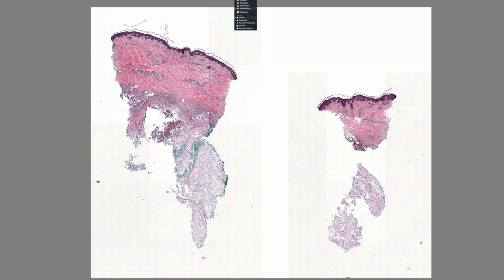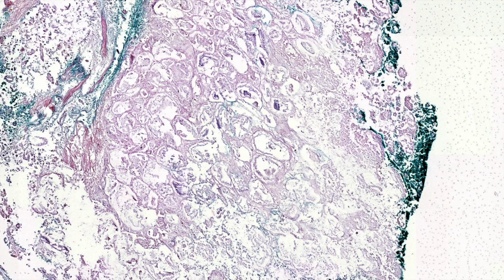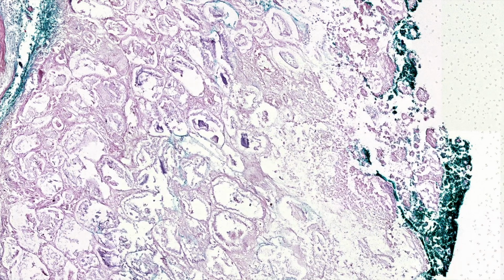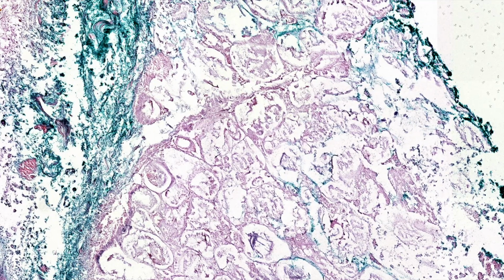I can take this one. Okay. So we're looking at a punch biopsy, and you can see a cellular infiltrate in the deeper dermis, and then it looks like inflammation of the fat lobules. And the fat lobules have a little bit of a bluish hue to them, and some necrosis that looks like saponification. I feel like it kind of looks like garlic in cross section. Yeah, that's what it reminds me of. But it looks like pancreatic panniculitis. Yeah, it's this very distinct pattern.